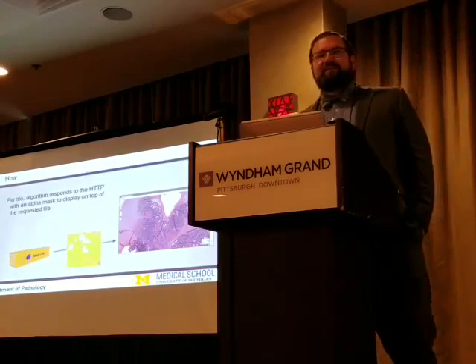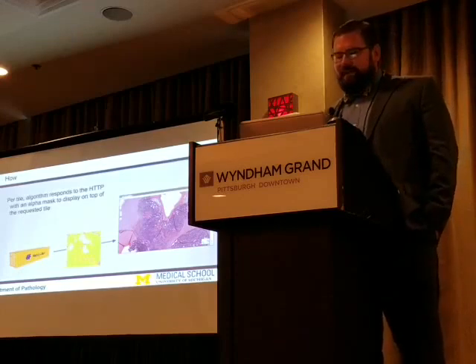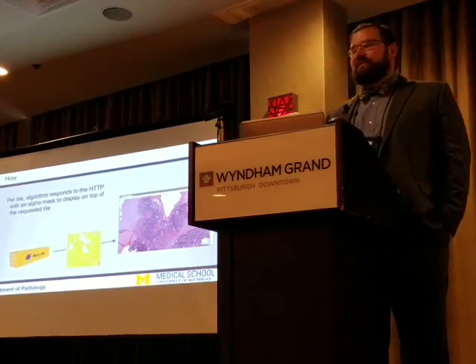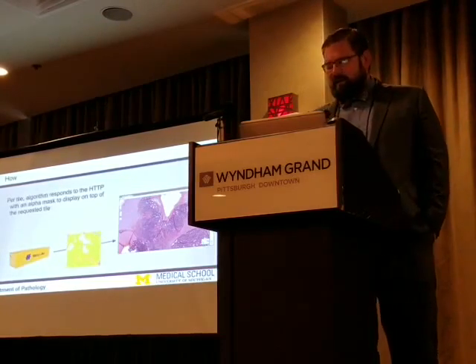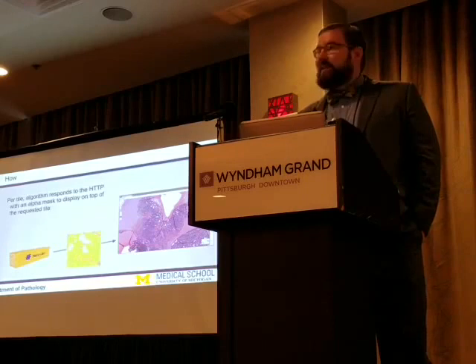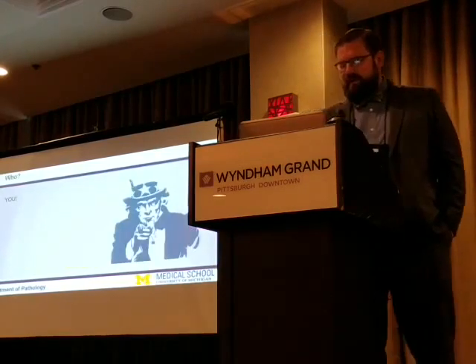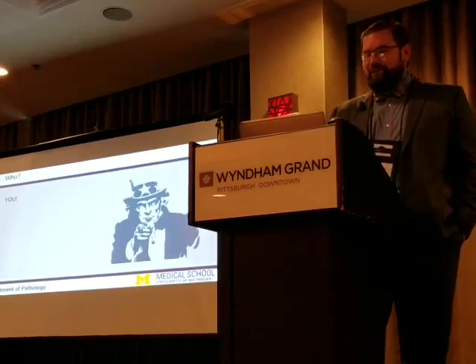So once the processing is complete, there may be some type of quantitative value. In our case, there's actually an alpha mask that's returned to the viewer that's simply laid on top of the tile, and so the viewer can display that to the user. So my question is, who cares about that? And I would propose that you do.